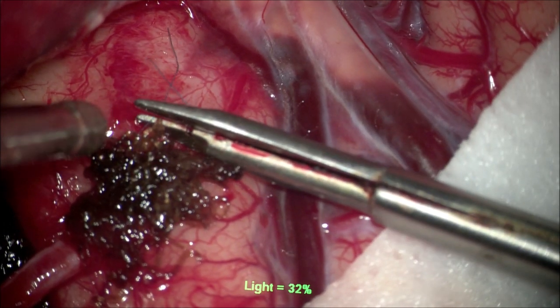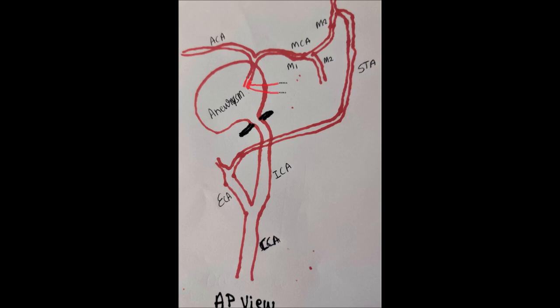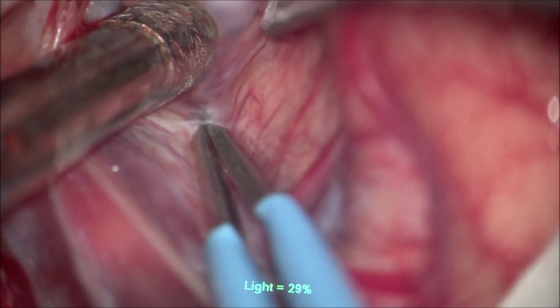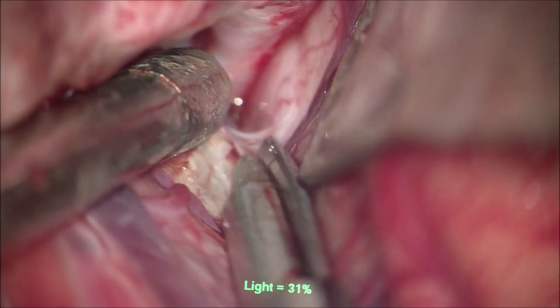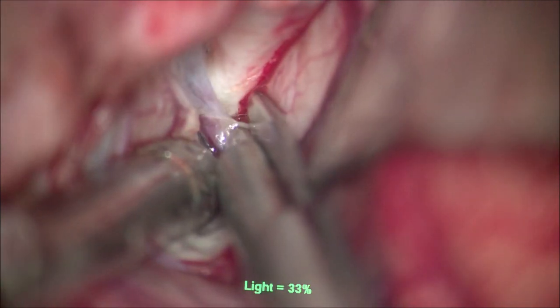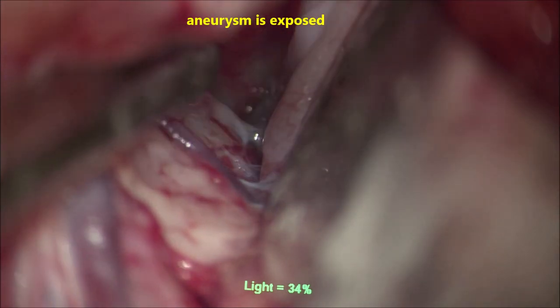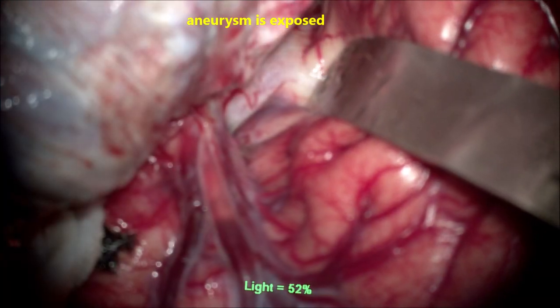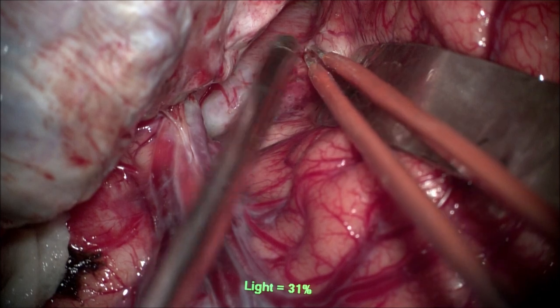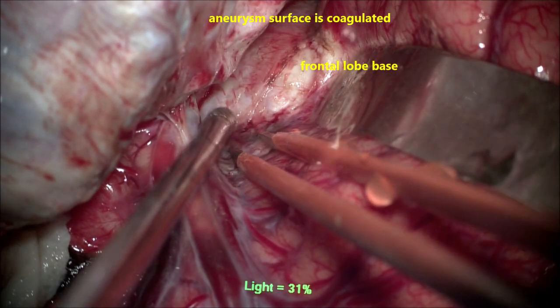The ends of the sutures are cut. This is the pictorial demonstration of the anatomy at this juncture. The next important step is to open the sylvian fissure from lateral to medial — it is preferable to open the fissure wide and deep, which is very important to expose the bifurcation of the ICA and demonstrate both MCA, ICA, and ACA. The medial end is reached and the carotico-optic cistern is also opened. A quite large aneurysm is now seen, inseparably fused with the basal frontal lobe.